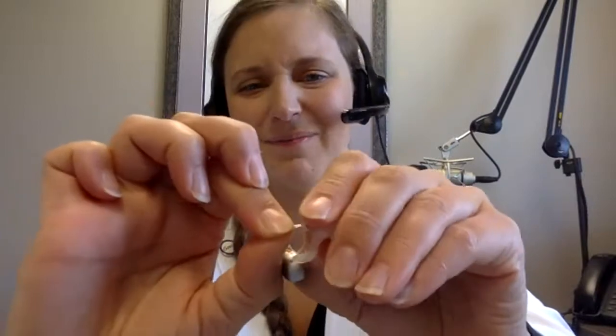this mold here. So always do one at a time so you have a reference hearing aid to know how it goes back on. Because if you take them both off at the same time, because you're trying to be efficient, which makes sense, you can get yourself into a little bit of trouble. You can get it on upside down, backwards. We don't want to make your ear sore by getting it on there wrong. Again, these are going to be in there pretty tight, so it doesn't come off in your ear. So you might have to give it a little bit of pull to get that through. There we go, just like this. And then we can change that filter like we did earlier.